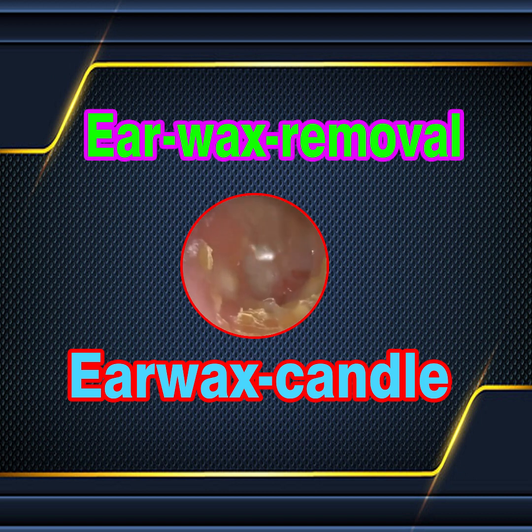Now, we're not going to get every little aspect, guys. There's always going to be bits and bobs here, but I'm going to try to remove as much as possible. At the base, it is quite narrow, so it's quite tricky. But already you can see the difference between this patient's ear on attendance and at this stage, less than a third of the way through. So we are going to spend a bit more time mopping up.